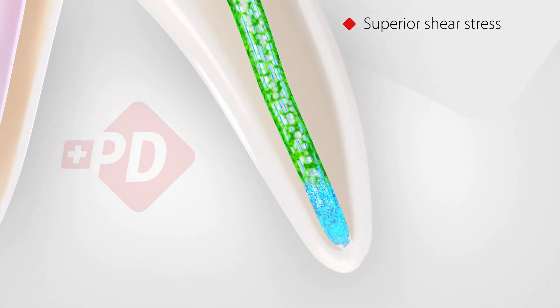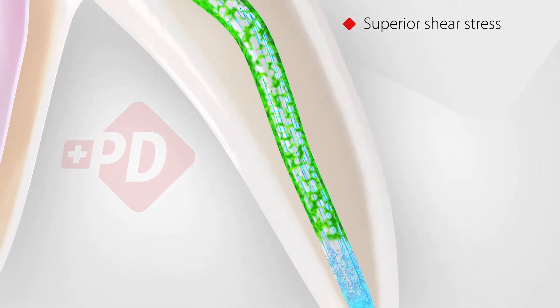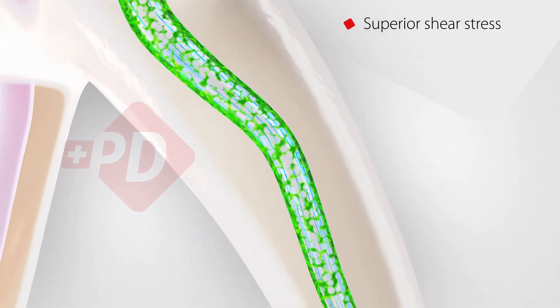Unlike conventional metal needles, the higher solution flow rate and the reduced space around the needle significantly increase the wall shear stress along the root canal. The superior shear stress improves the cleaning efficacy and mechanically removes more residues such as debris, smear layer and biofilm from the root canal walls.